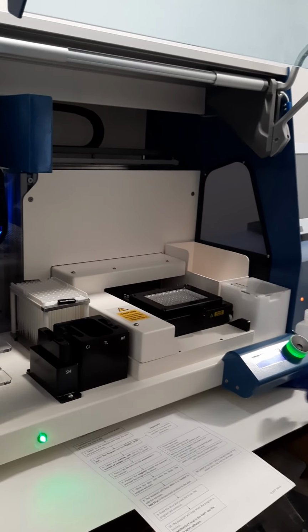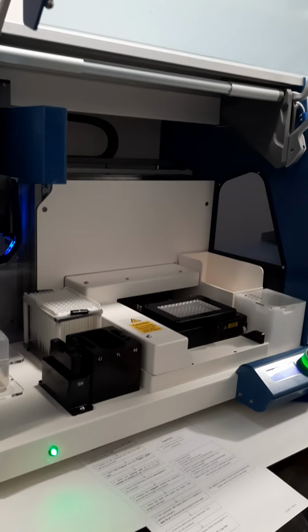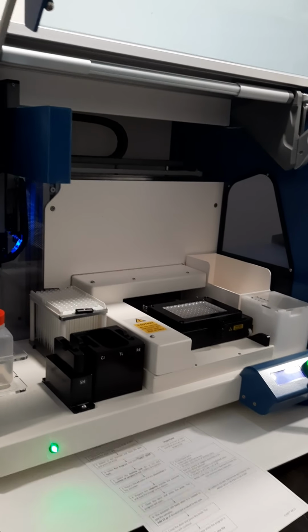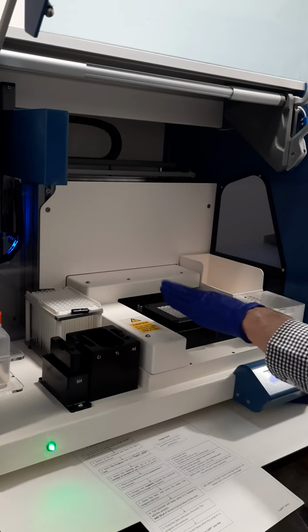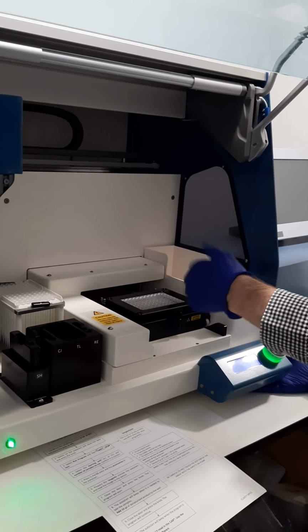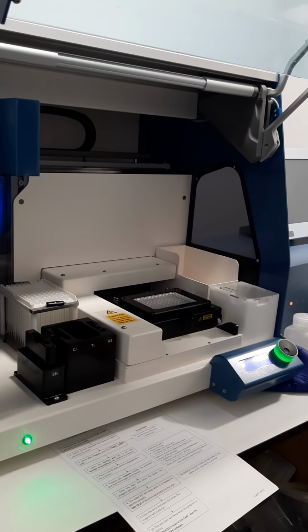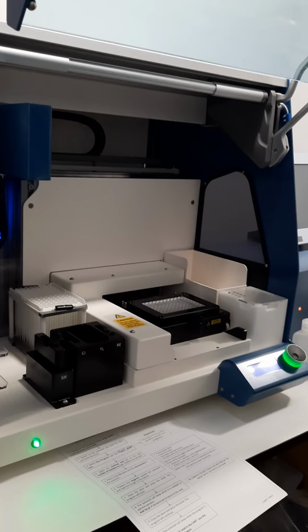Then we add the hybridization solution, the one that we have heated and so on, directly from the bottle, 1.8 milliliters here. The hybridization solution is the solution that the machine is going to add to these wells, and then we are going to add the DNA in this buffer in order to have the hybridization between the amplified product and the probes that are printed in the bottom.